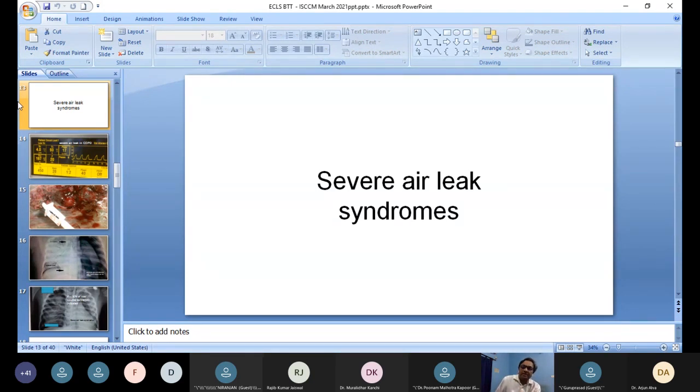And in this patient, again, a young patient who's waiting for a lung transplant, you set this right by getting the venous output to the machine from one of the cannulas and delivering some of that back down the venous side, but into the right atrium, in order to make sure that there is some oxygenated blood going to the cerebral and coronary vessels, so that there's no cerebral or coronary ischemia to the upper part of the body. This is important as a part of bridge, because when you have patients who are deteriorating quite fast, you may put a single cannula and then you may find that's not adequate. You may add another cannula.